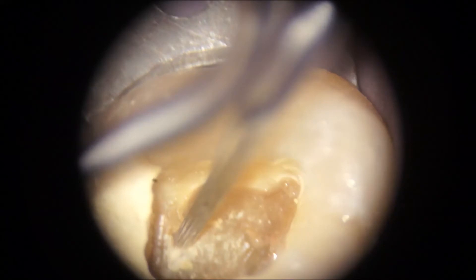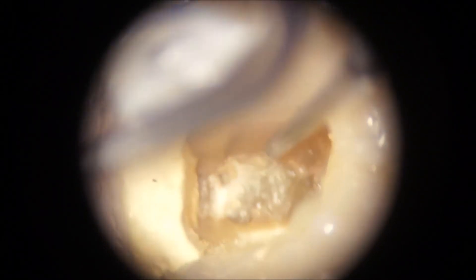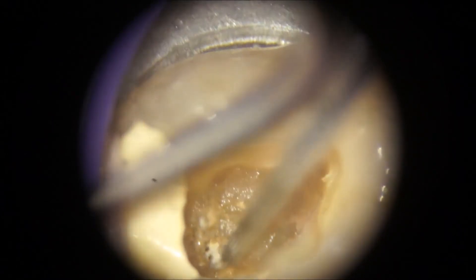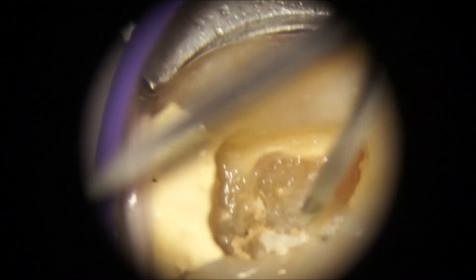I find it works easiest in my hands to use the StarTex number 3 tip to trough on that joint between the grey reactive dentine and the yellow secondary dentine. A lot of spray on the mirror as always — I like to keep the tips cool.